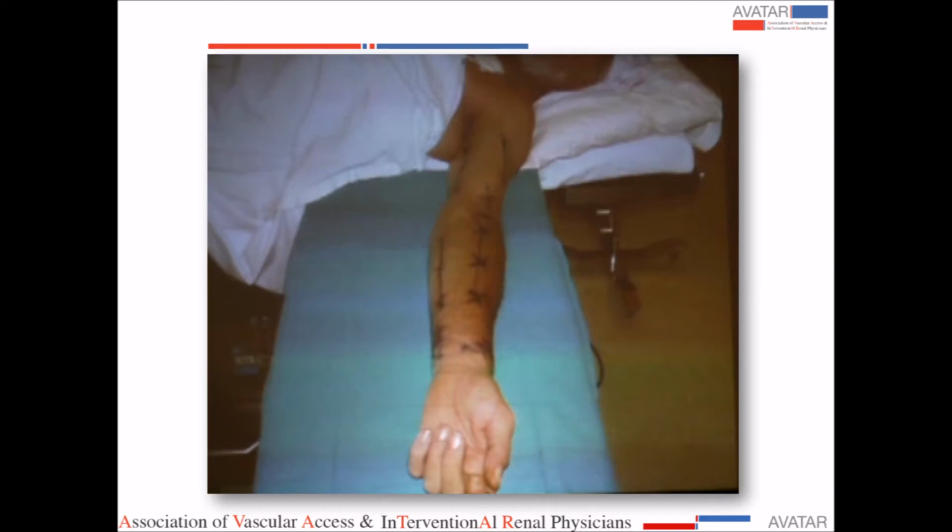So once I do the vascular mapping, I don't just give a report, and this is what I encourage every nephrologist to do: we give them a plan A, B, and C. So we give them recommendations for what the access should be. I have a small case that I'll illustrate that with, but basically you want to tell the surgeon, I want a radiocephalic fistula. If that fails, I want a brachiocephalic and then a brachiobasilic. But you have to lay it down, because sometimes people interpret it differently.